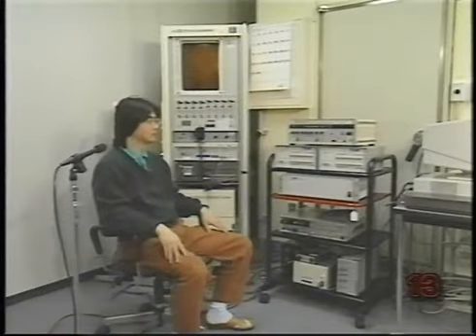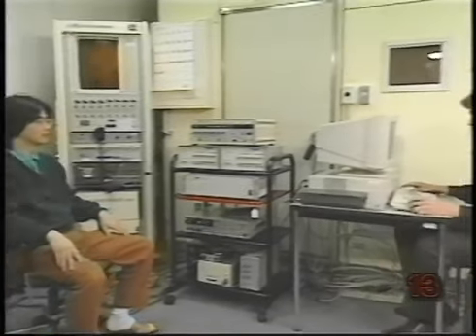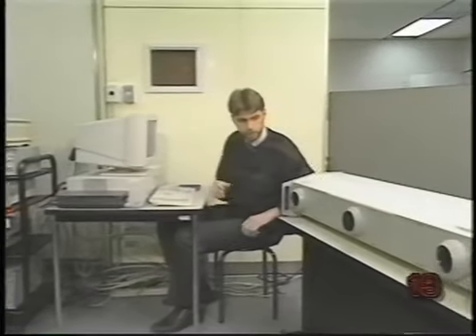Yes, very busy. Speech production involves the coordinated activity of many anatomical structures, including the lungs, larynx, tongue, jaw, and lips. Of these, only the jaw and lips can be observed fairly easily and non-invasively, because their activity is externally visible. This video presents several experimental applications for examining these structures using OptiTrack, a state-of-the-art optical tracking system that accurately measures three-dimensional position of infrared light-emitting diodes attached to the structures of interest.